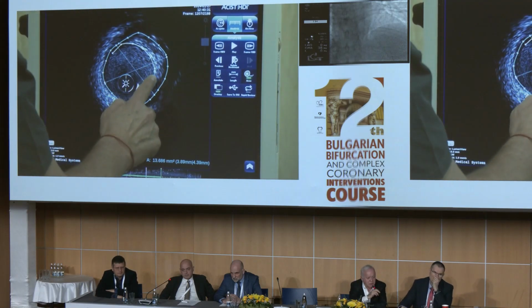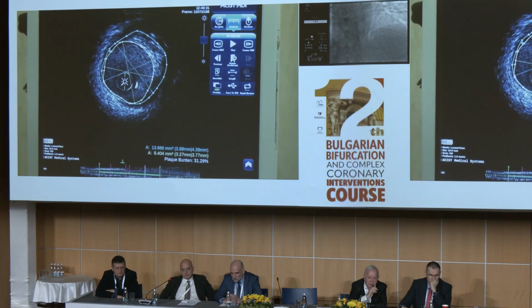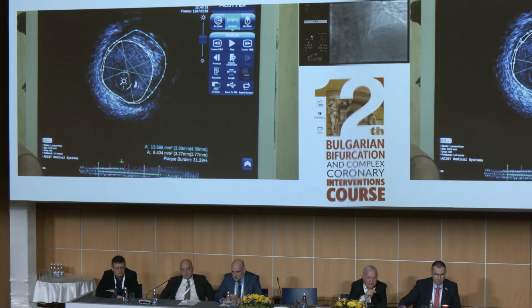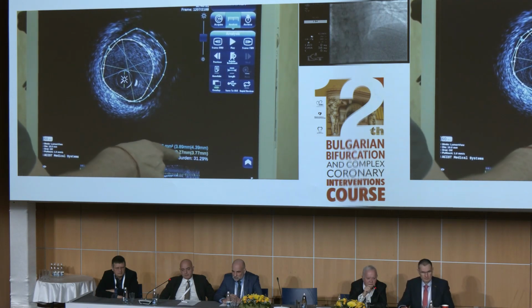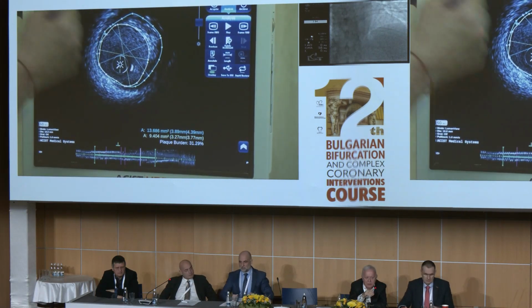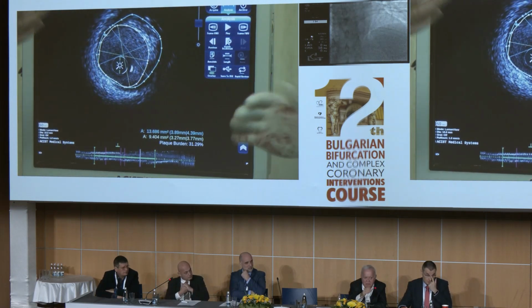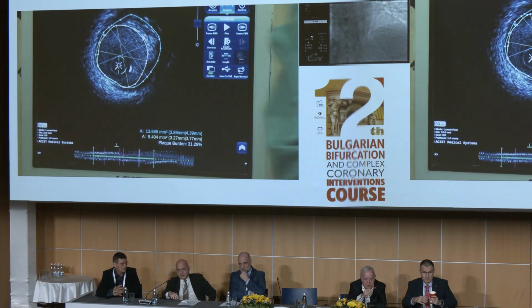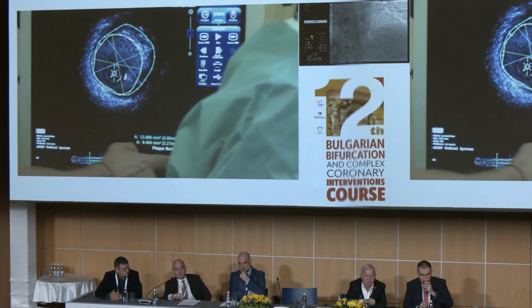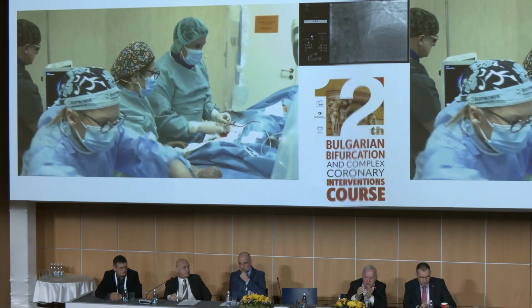That's a good question, because in this kind of lesion we can have expansive remodeling. That's why sometimes when you follow the data of IVUS, especially media to media, you may close the side branch. I have seen this occur in China, in the group of Chao Yongshen. Let's insert a second wire in the circumflex, because it was closed, then remove the wire and implant the stent. The vessel can have positive remodeling at the level of the lesion.